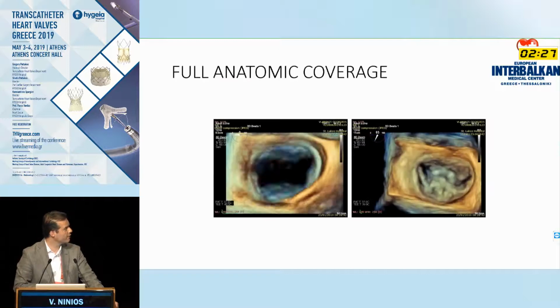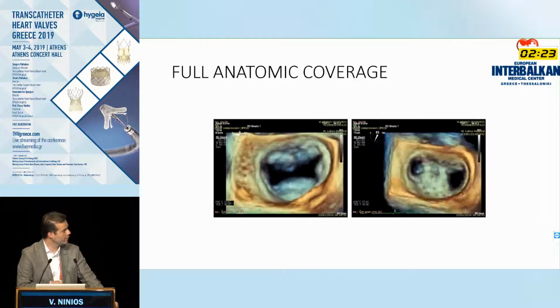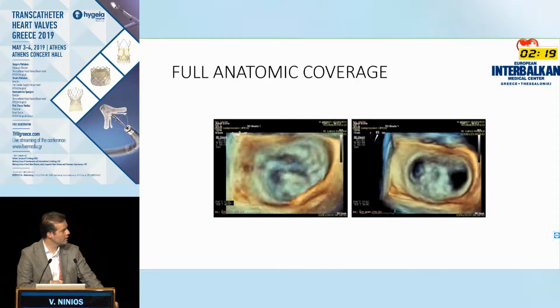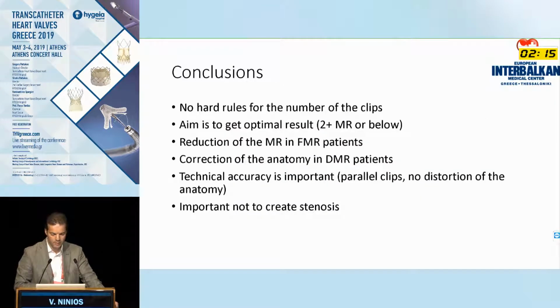Now, you have to fix the anatomy, and here is what the flail width looked before and what it looks now. Clearly, you only have the commissures left, and this is totally stuck together with the anterior leaflet. So I hope with this example, I was able to illustrate some technical aspects of how we can make decision about the number of the clips we can use for the cases.